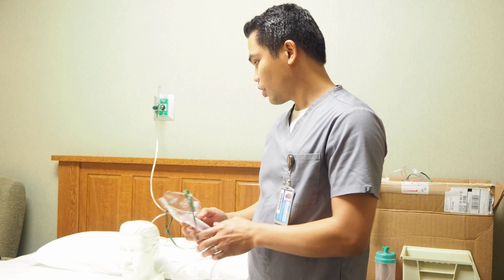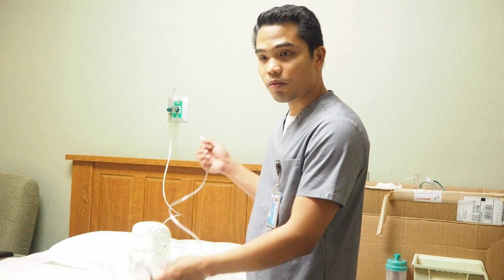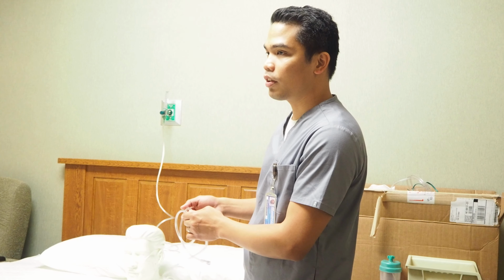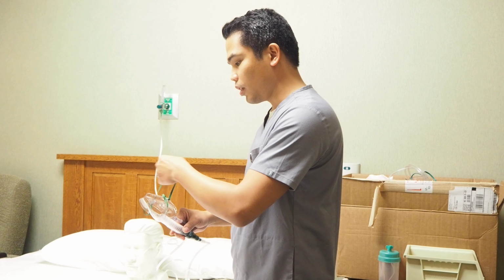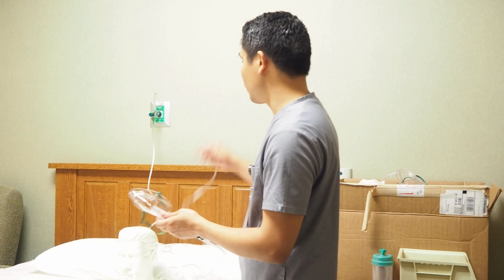We also noticed the patient's ABG showed CO2 high, more than their normal values, and their oxygen levels had dropped. So I immediately attached a Venturi mask. In that way, the patient would receive a precise FiO2 regardless of the flow.